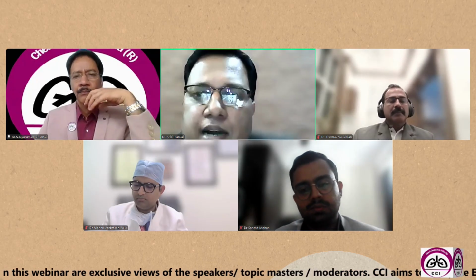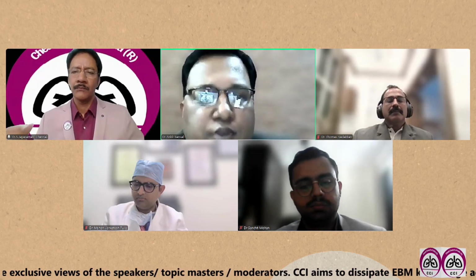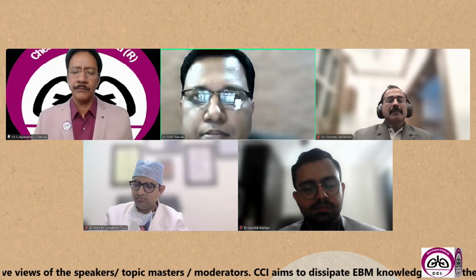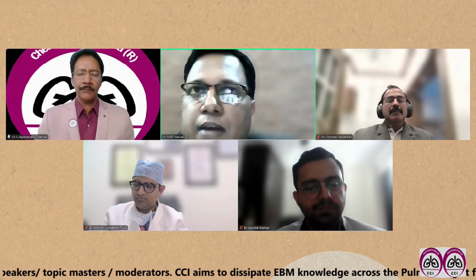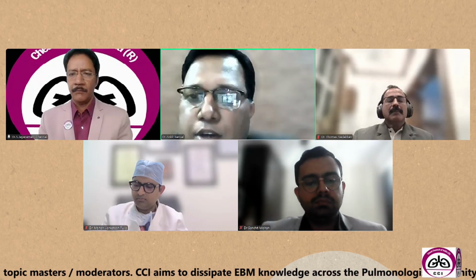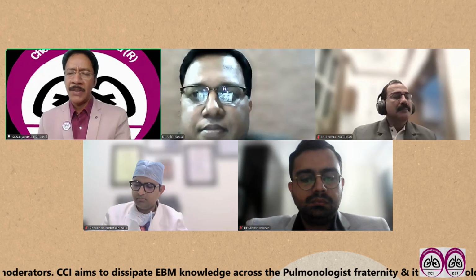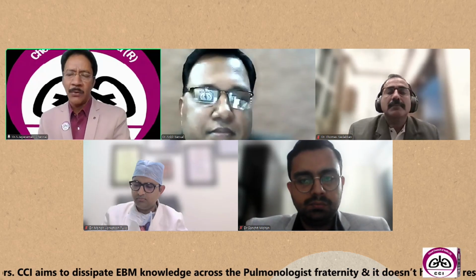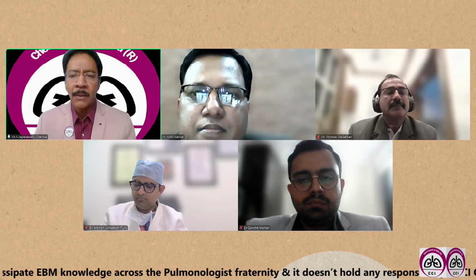For beginners, definitely yes. But as we gain experience, some people are more comfortable working without Doppler. But for a true study, Doppler should be used before each and every puncture. Okay, fantastic. So Doppler is a very essential tool. So always utilize that to avoid unnecessary injury to our vessels. Thank you. Over to Dr. Thomas, sir.